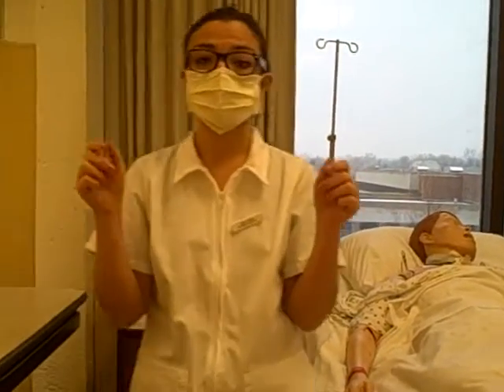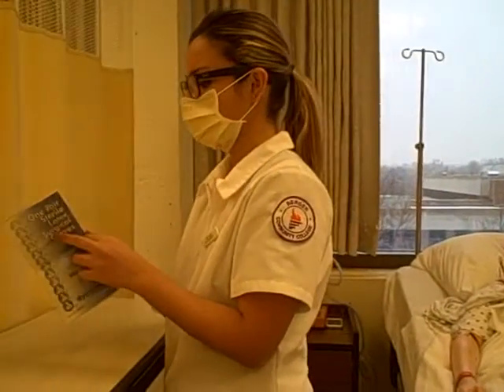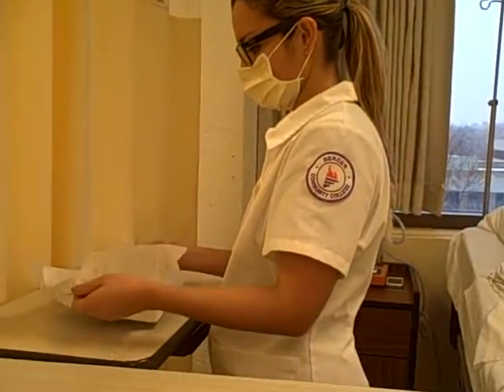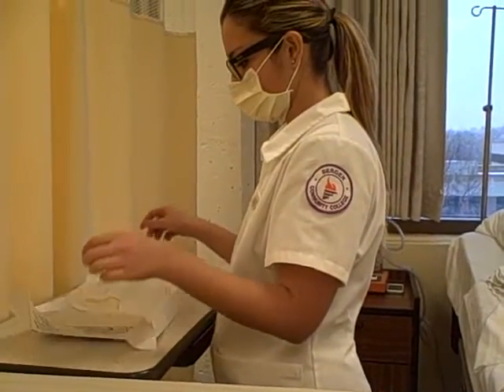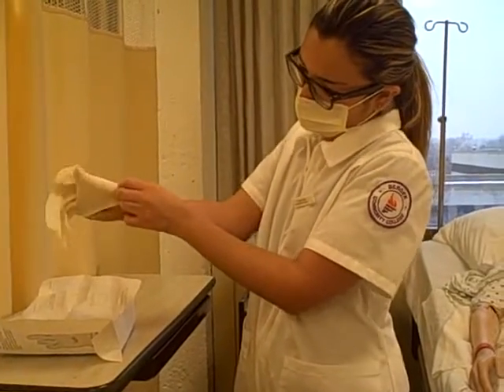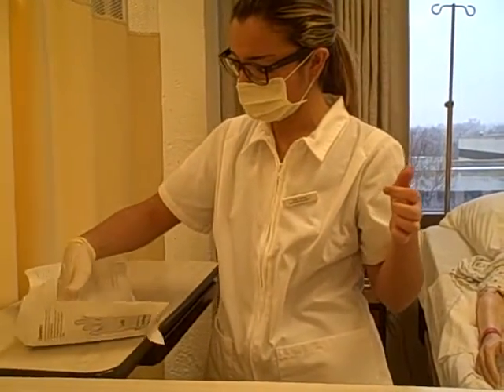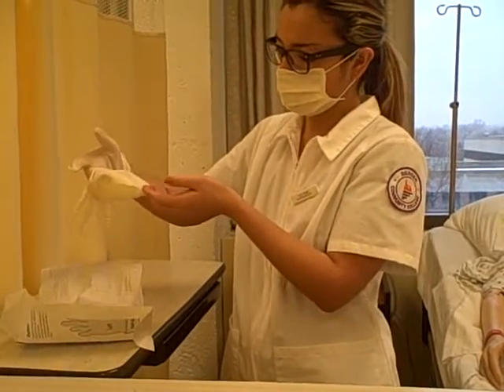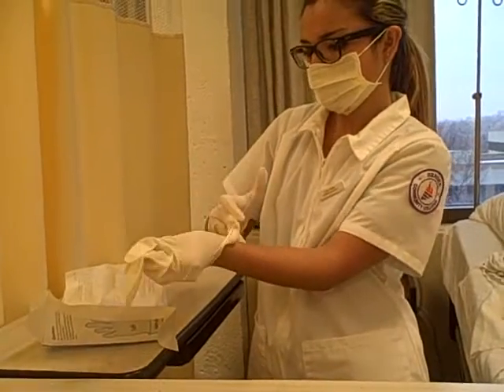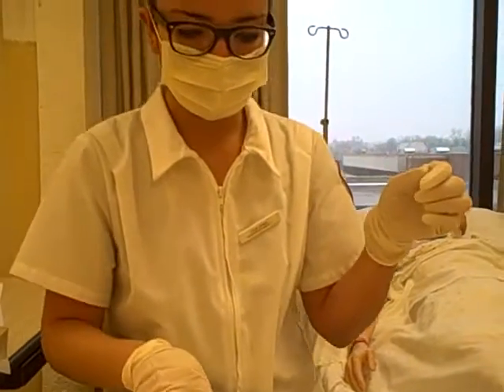At this point, we're going to wash our hands one more time, and we're going to take out our sterile gloves from our pack. Cuff. Sterile to sterile. There we go. We're going to go ahead and open our pack.